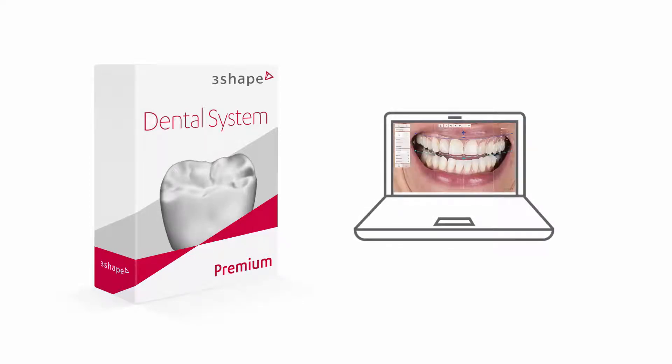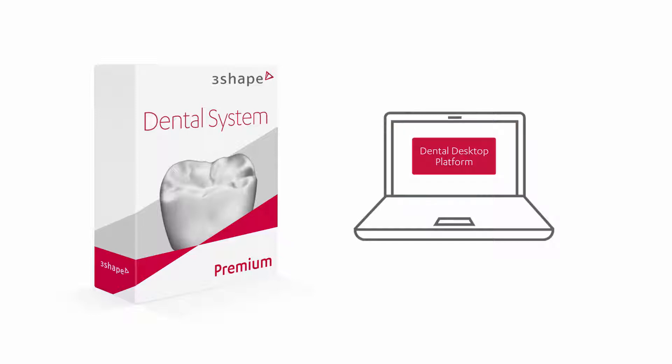To have Smile Design installed while installing 3Shape Dental System, the user needs to have a 3Shape Dental System premium license, which includes the Smile Design software. The Dental System with Smile Design installation should be done on a clean computer where the 3Shape Dental desktop platform is not installed.